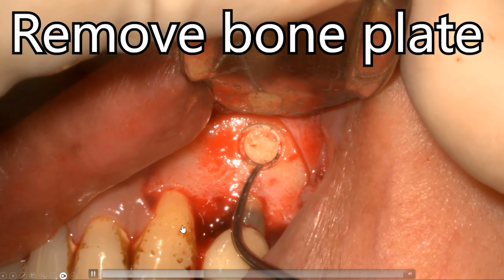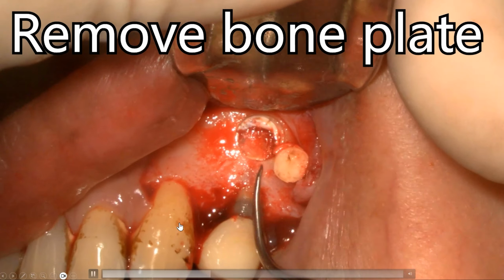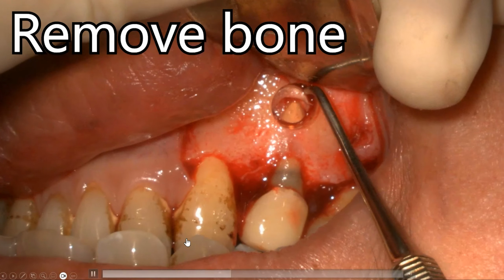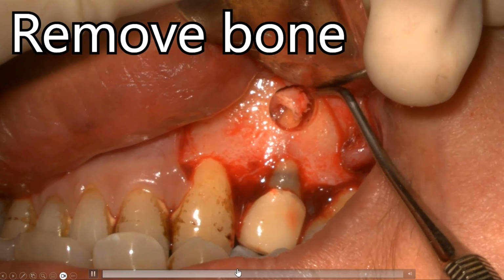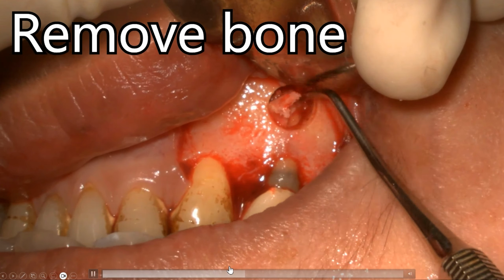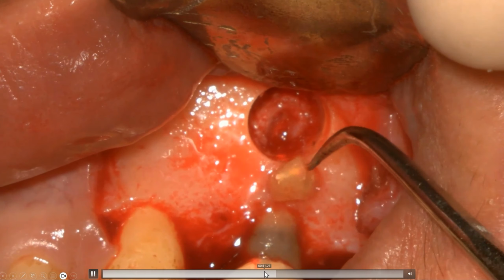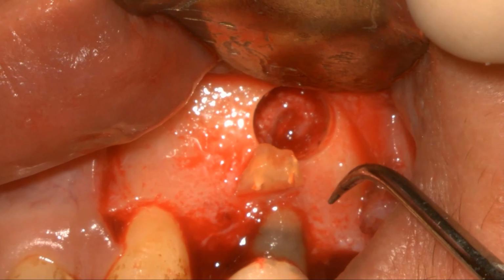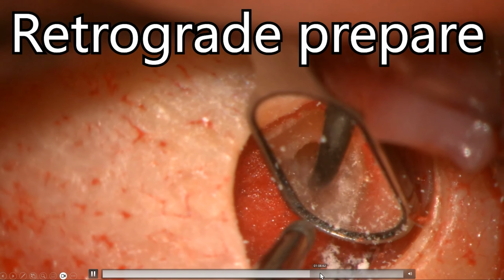And I remove the bone, remove the bone plate, and remove the apical part of this tooth. As you can see, there are two holes of GP. Okay, so I do the retrograde preparation, put some collagen here, and put the bone plate back inside and suture.